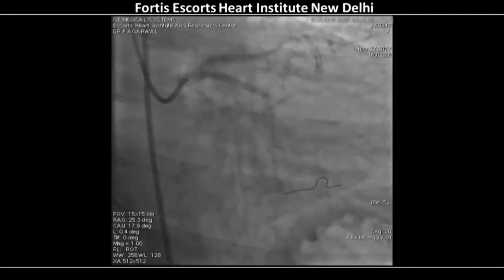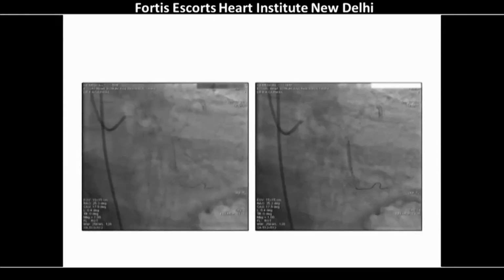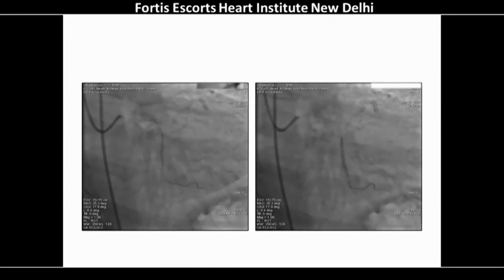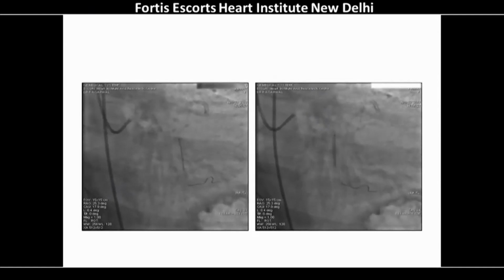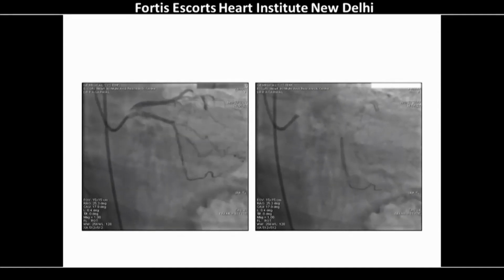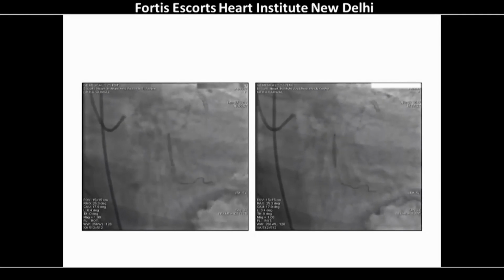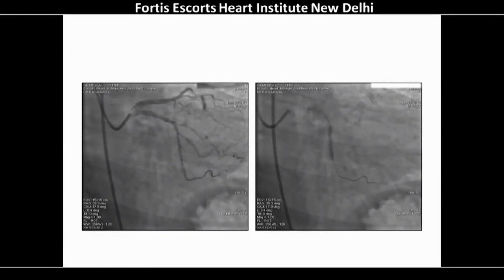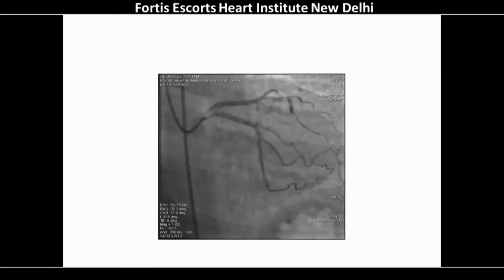Next, please. It was a 2 into 18 millimeter stent, deployed at reasonably high pressures. Then a high pressure dilatation was done, taking a 2.25 balloon. Next, please. And it was a reasonable kind of result at that.